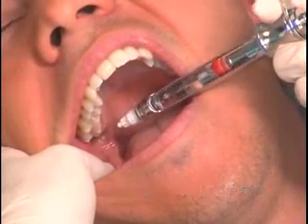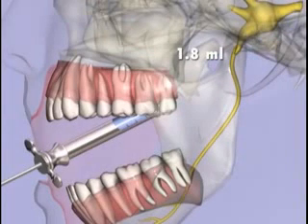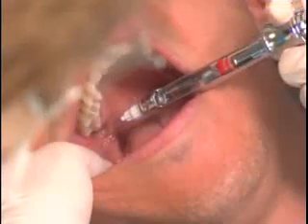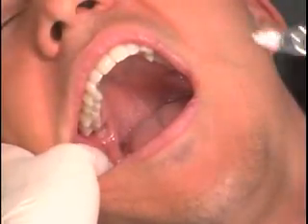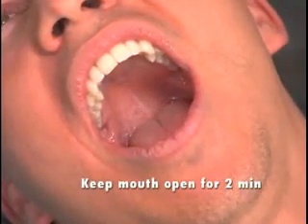After negative aspiration, 1.8 mLs of anesthetic is slowly administered. Following withdrawal of the syringe, the patient is asked to keep their mouth open for 2 minutes.